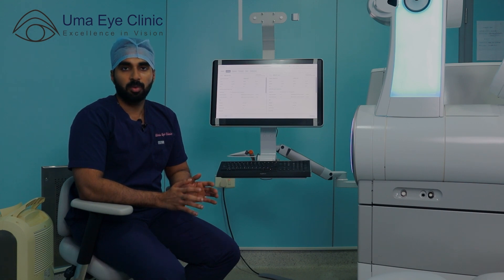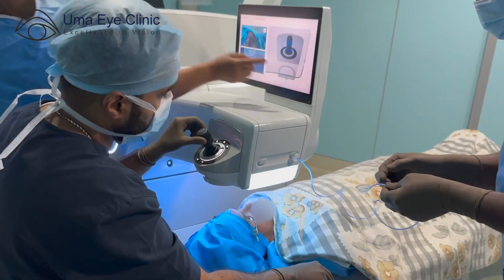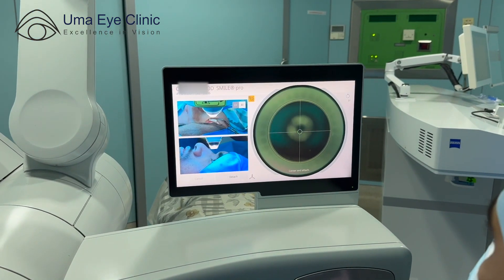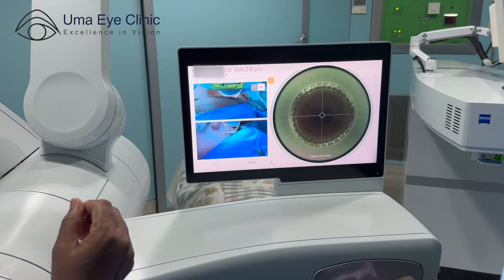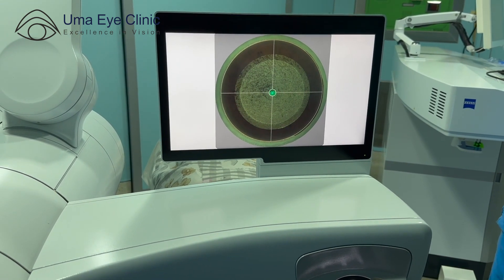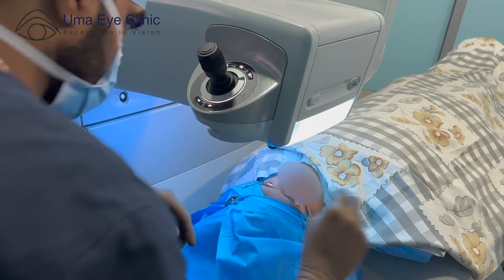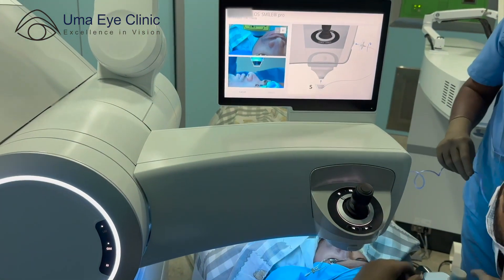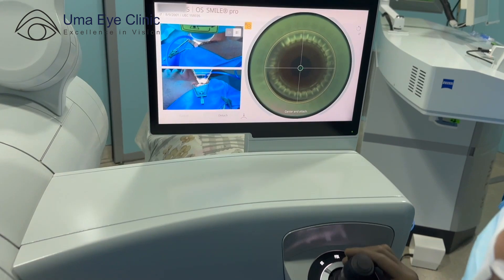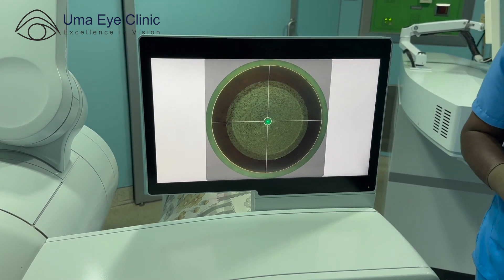Now let's start the procedure. First, we apply the laser in the right eye. After that, we apply the laser in the left eye. The surgery is fast. When you cooperate and look at the green dot, we will finish the procedure in about 10 minutes. Now we have done the laser on both eyes.